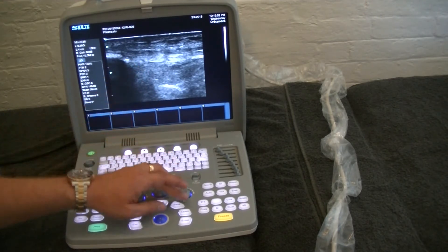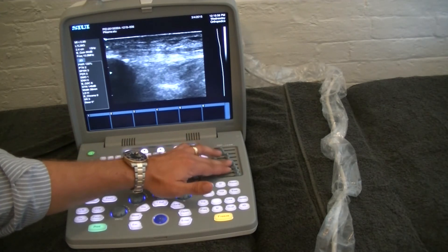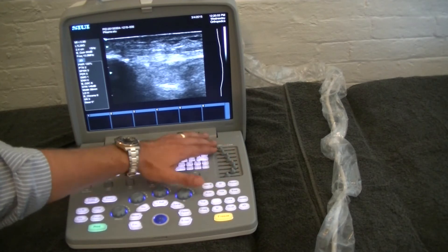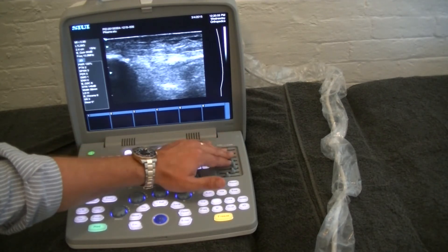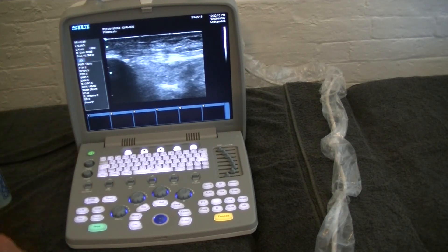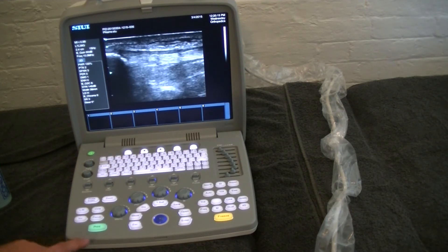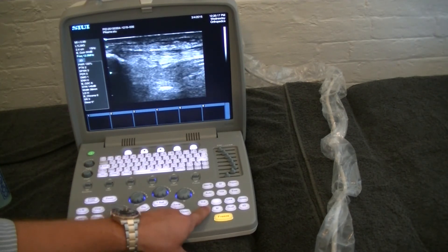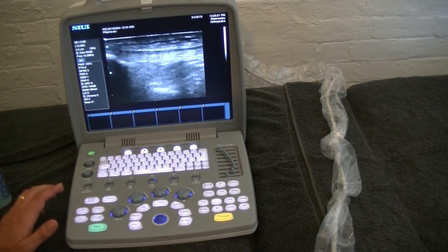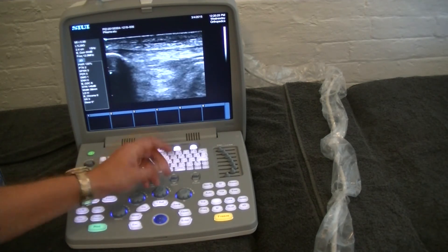We're getting a little bit more brightness. Next I'll adjust the time gain compensation to get a little bit more brightness in the area of interest. Here you can see the gain and the frequency — we're going to look at increasing the frequency to see if we can get a slightly better image. We hit frequency and it takes us to 12, which is our highest. I'll also increase our gain to adjust the image further.